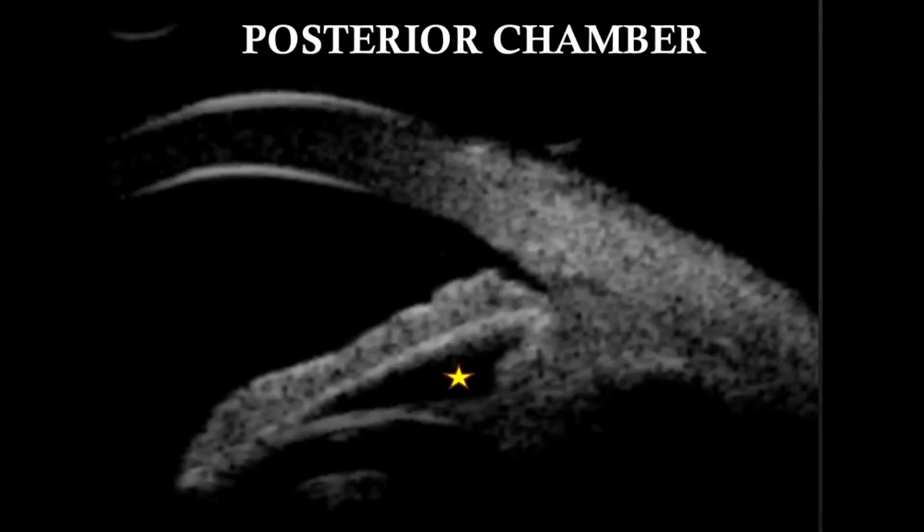The echo-poor region bounded by posterior iris, ciliary body, zonule, and anterior lens surface is the posterior chamber.